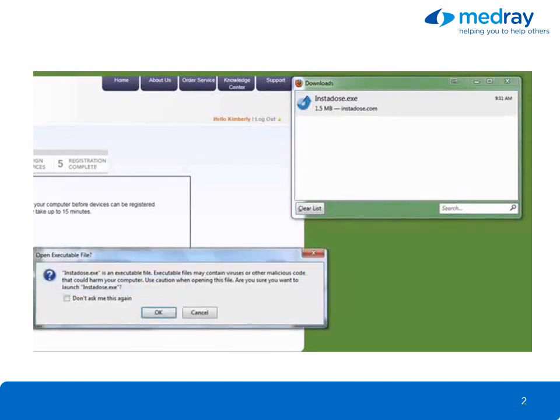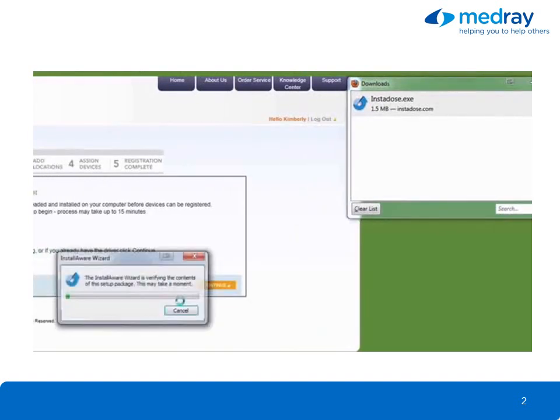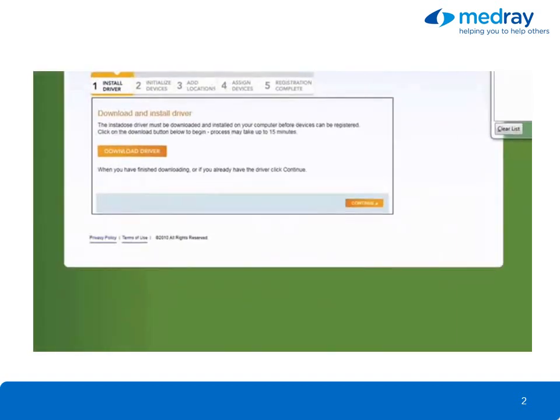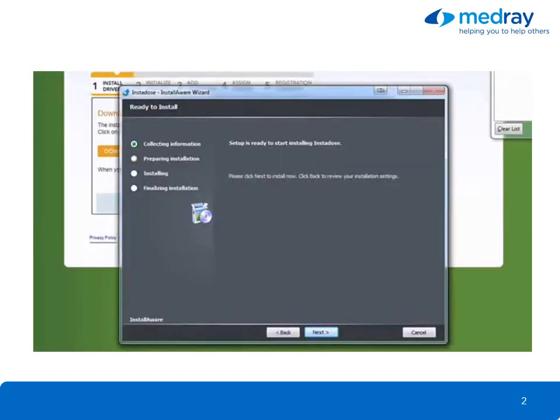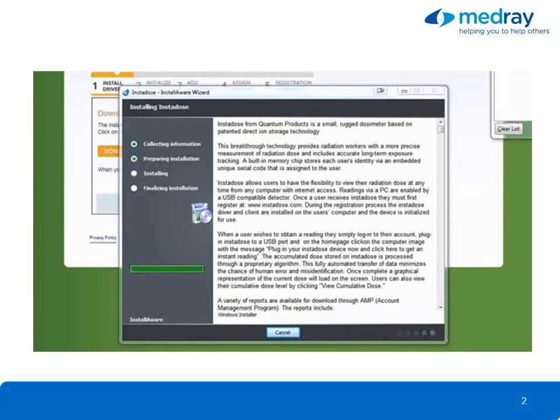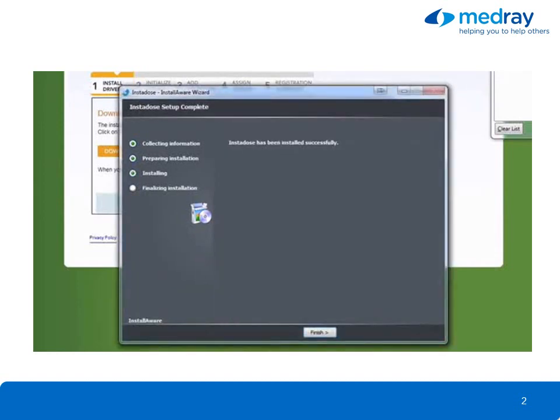A security warning message will be displayed. Click Save File. Click Next to install the InstaDose driver onto your computer. This process can take up to 15 minutes depending on your system. When the InstaDose setup is complete, click Finish.